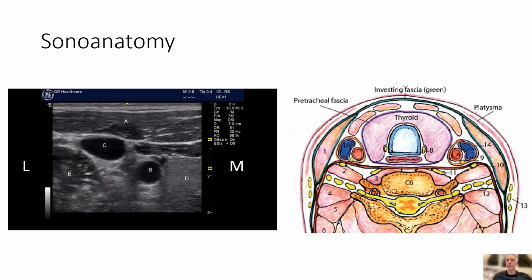It is important to be able to recognize some of the surrounding sonoanatomy, in particular identifying an internal landmark that can help you identify the object of interest efficiently and accurately. The internal landmark should be a structure that is consistently easy to find, even when the object of interest isn't. In the case of the internal jugular vein, the carotid artery is a useful internal landmark.